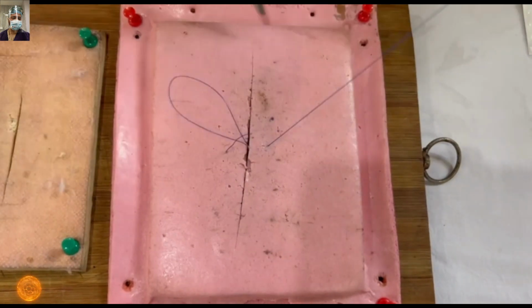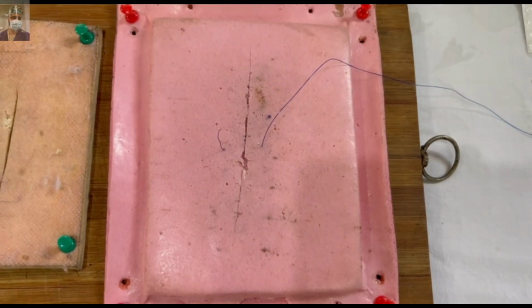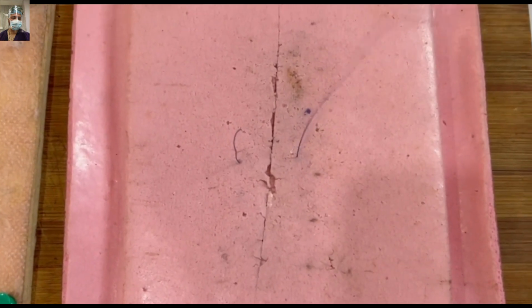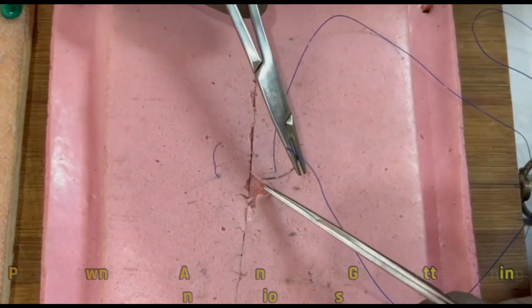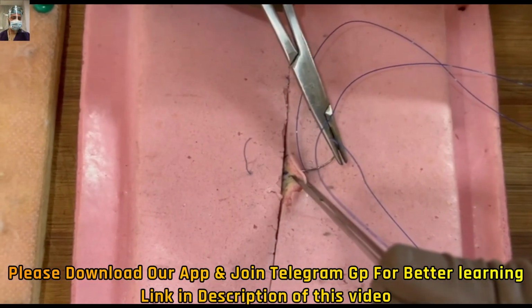So again, we go through the other edge. Don't take the 2 bites at the same time. These small tricks, small tips I'm sharing, please do remember. Watch these videos time and again, friends, so that you learn things the right way, you practice them the right way, and you become a good surgeon.